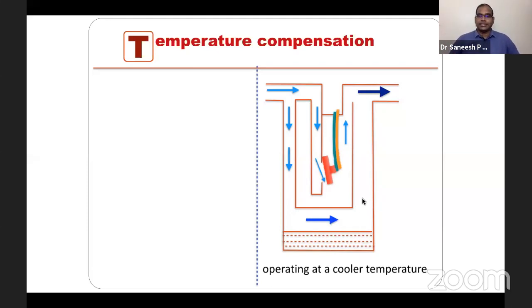Okay. It's just like initially the liquid was warm enough, so you are getting good enough enthusiastic workers to do the job. Now the liquid starts cooling. So the enthusiastic workers are unable to do the job with the precision. So what you are doing is you are recruiting some more people from this bypass to go and take the vapor and come out, because the saturated vapor pressure is coming down. Okay. Previously, there were 100 molecules available above, so we could easily take. Now it's only 80. So we need more carrier gas to take from whatever is available.